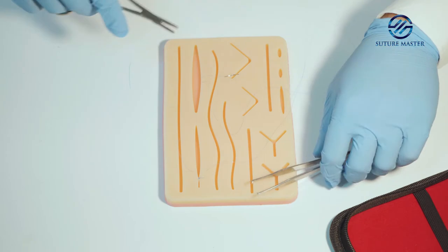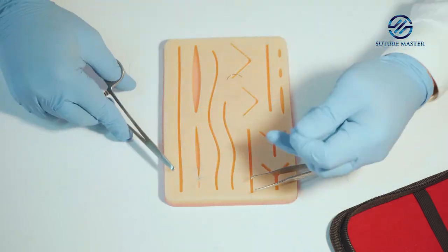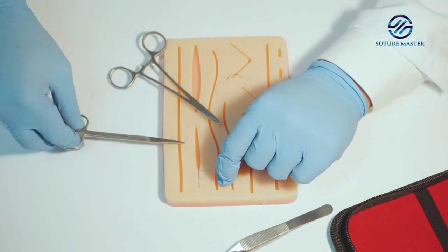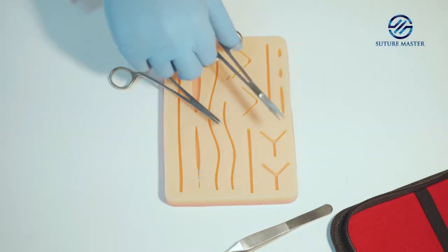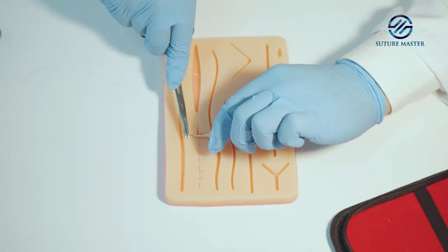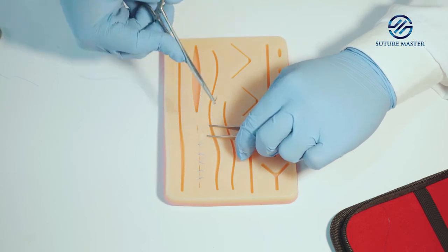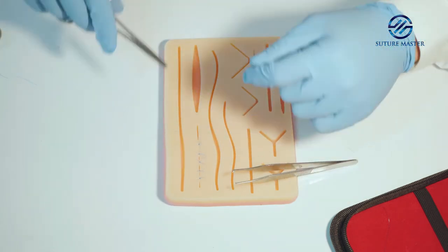To make the knot, loop the suture around the needle holder three times, then grasp the suture end. Now loop the suture back towards you around the needle holder twice, and finally loop the suture around the needle holder one more time.